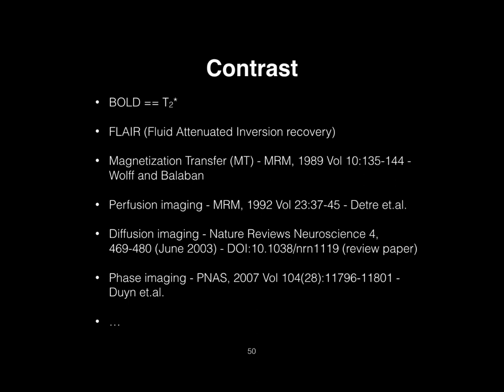This is another type of imaging where you've knocked out signal from cerebrospinal fluid, but you have less contrast between gray and white matter than you typically do in the T1 weighted example I showed previously. Okay. Magnetization transfer contrast looks at trying to get at the signal that's related to water molecules that might be bound by protein pools. Okay.